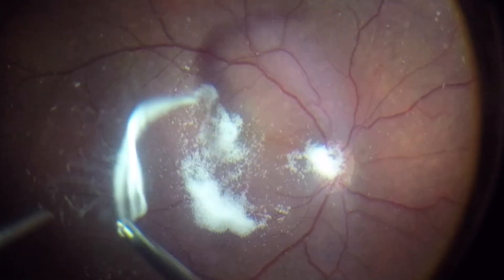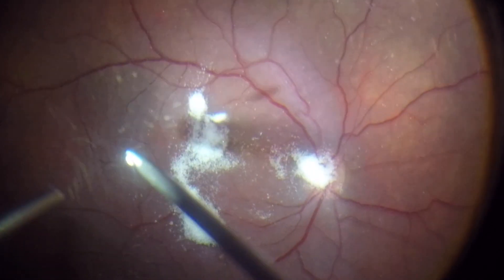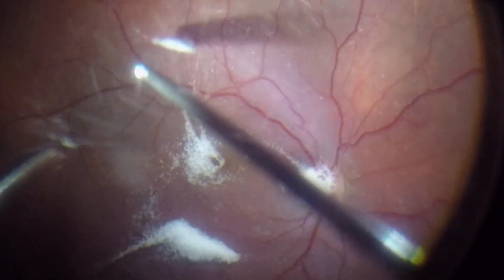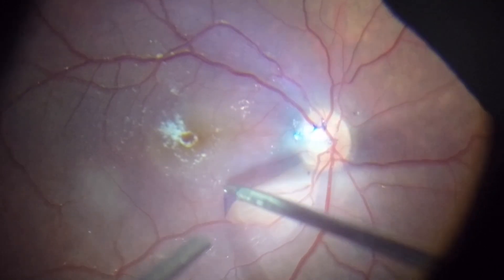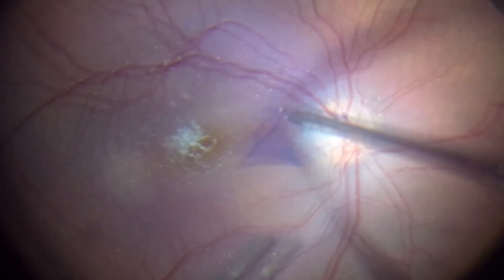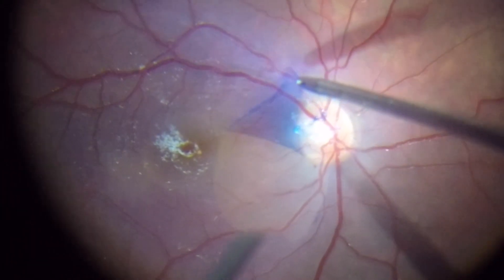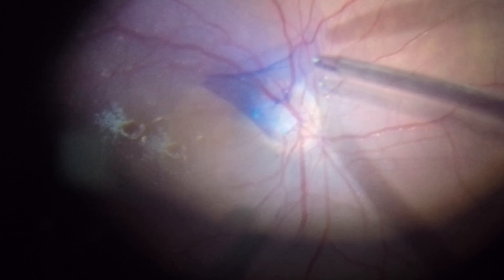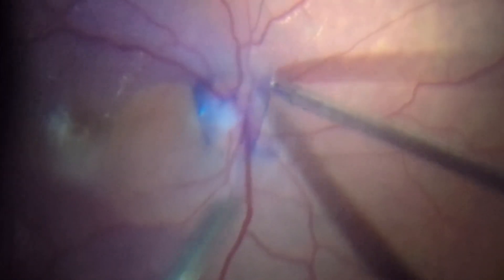In this case the surgeon used triamcinolone to stain the vitreous and to facilitate the PVD induction. Brilliant blue dye was used to stain the internal limiting membrane and the inverted ILM flap technique was performed.